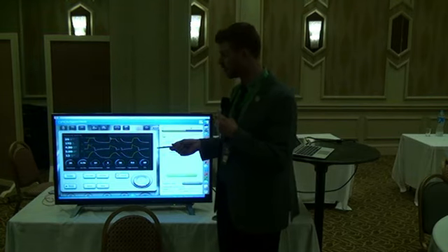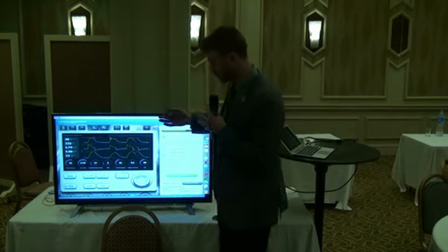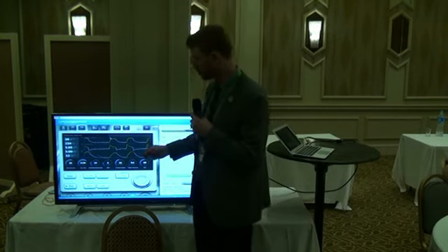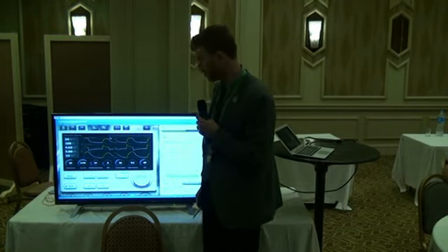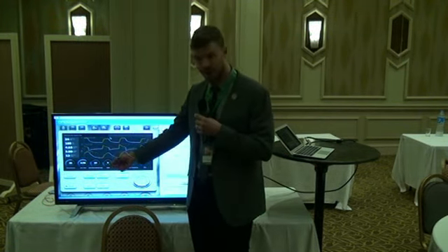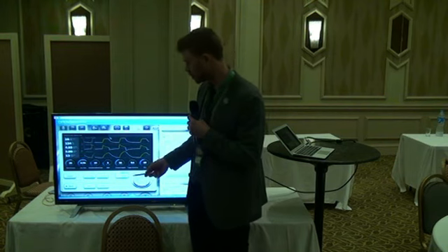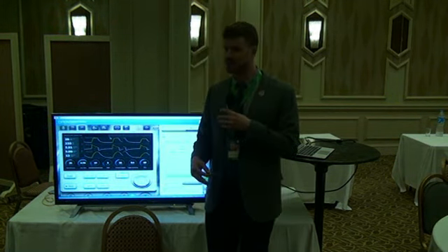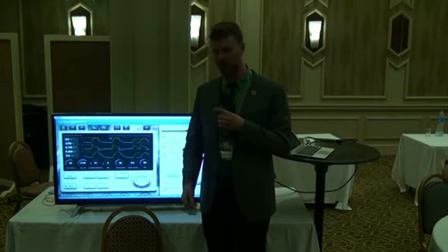Yeah, so exactly. The goal is to increase exhalation, the time for exhalation. You have a couple of different options. You can decrease the inspiratory time. It might be a little tricky because our volumes aren't that big, but it's definitely an option. And the other one we talked about was decreasing the respiratory rate. Actually, he didn't say decreasing necessarily, he said just don't increase, but we could decrease for sure.